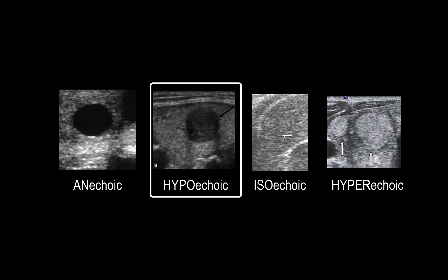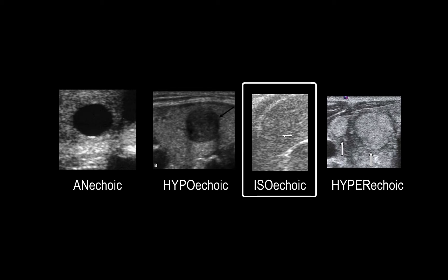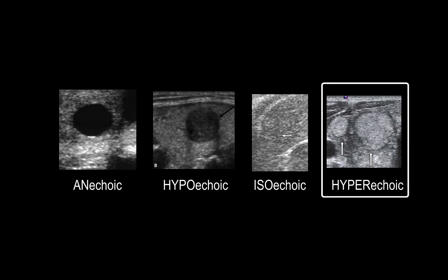The second image from the left is a hypoechoic structure in which there is some denser material within the fluid that leads to some artifact formation. The third is an isoechoic structure in which essentially all the tissue has more or less the same echogenicity. On the right side, the fourth image shows structures that block and reflect ultrasound waves much better than surrounding structures, as seen in these lesions.